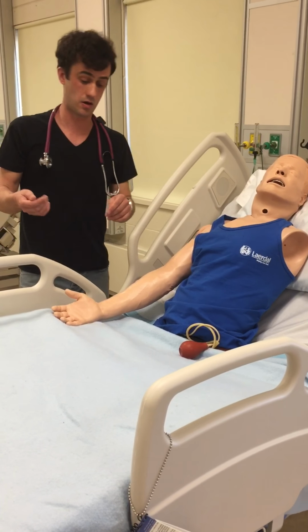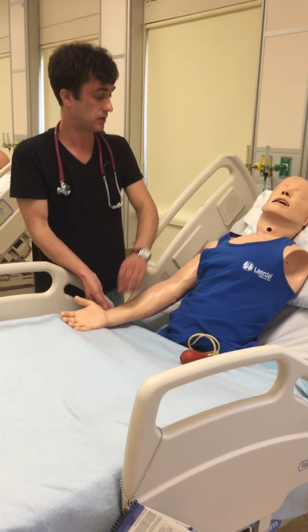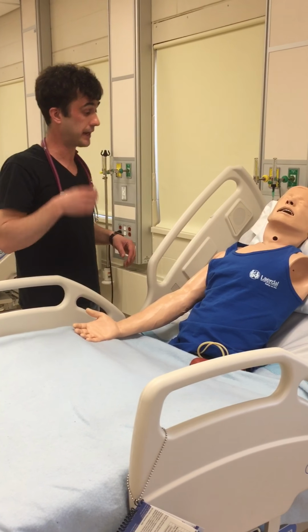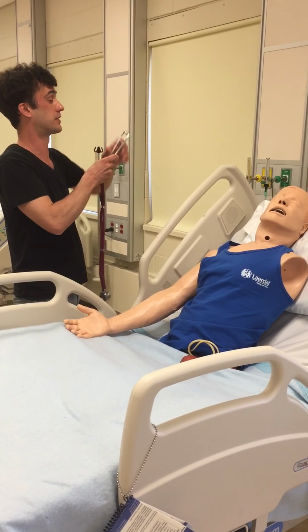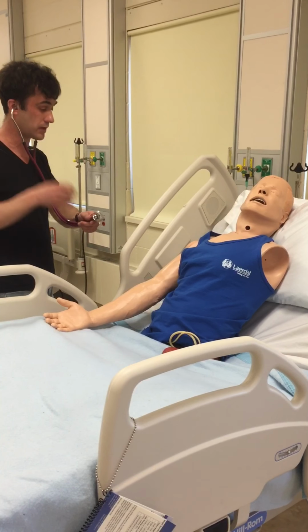I would again reassess the patient's vital signs, checking for pulse rate for a minute, the respiratory rate for a minute, and the oxygen saturation level. At this point, I would direct the patient to cough, and after coughing, I would reassess his breath sounds by listening to them using my stethoscope.